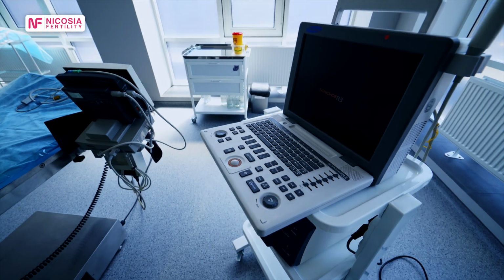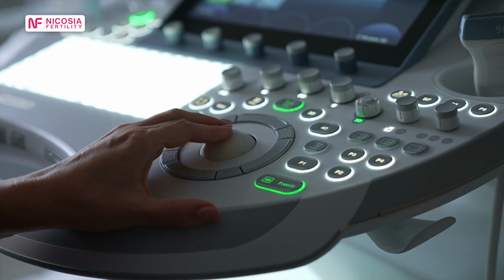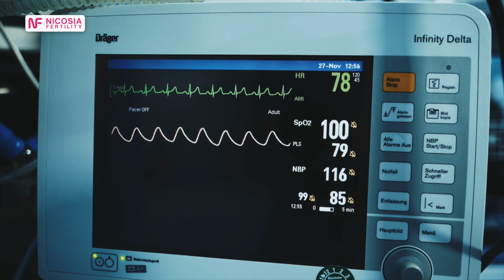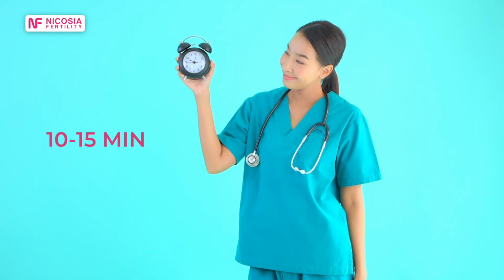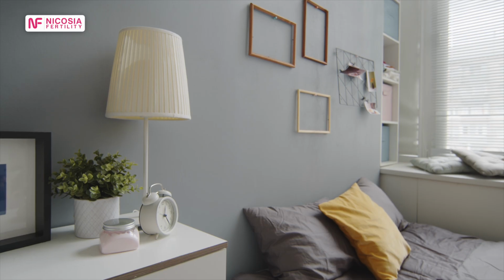The retrieval is done under anesthesia in the operating room using a needle guided by vaginal ultrasound to collect the eggs from the follicles, a procedure that typically lasts between 10 and 15 minutes. Afterward, the patient can usually go home within 2 to 3 hours, advised to rest for the day.